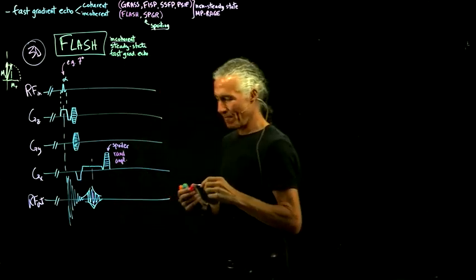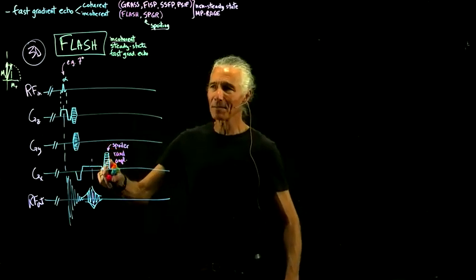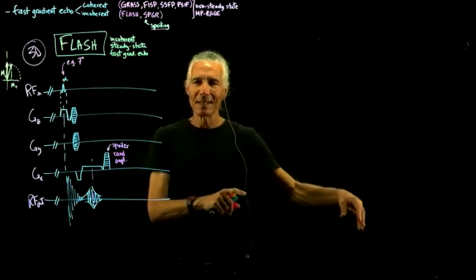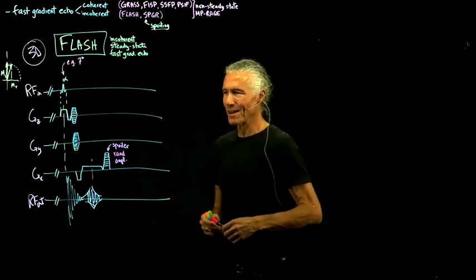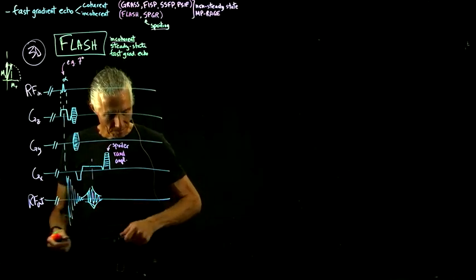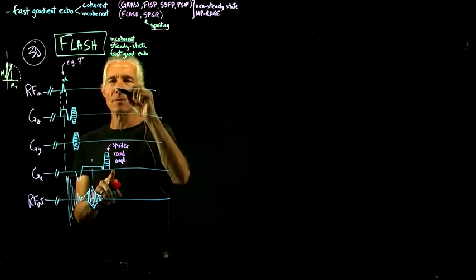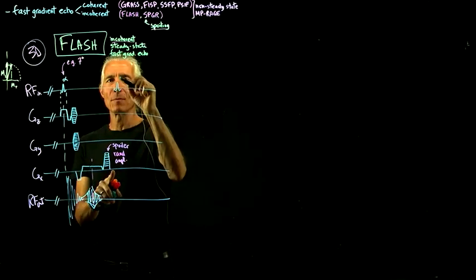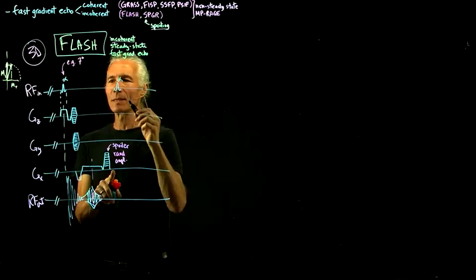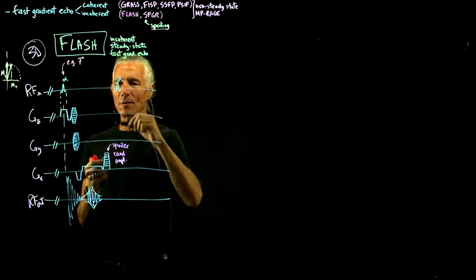To just kind of mess it up. So sometimes you mess it up a lot, sometimes you mess it up less, and that just gets it out of there, just gets it out of your hair. And so then what you can do is, at this point, just do another RF pulse, another alpha pulse, assuming that you wiped out any magnetization that was still there.